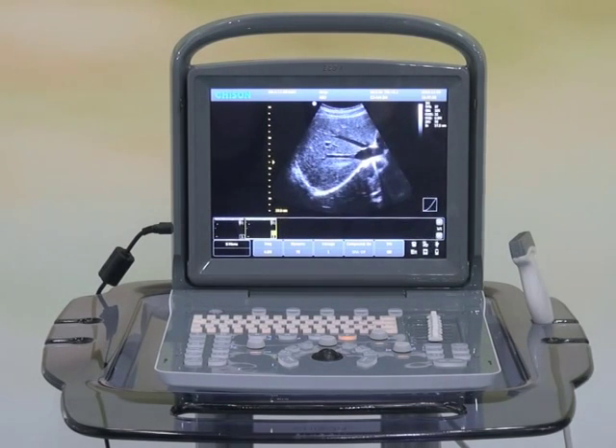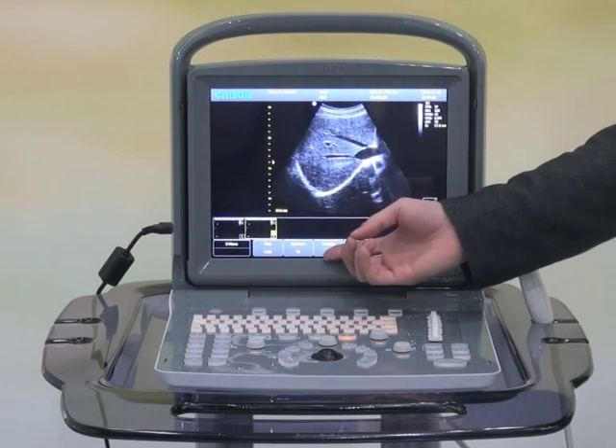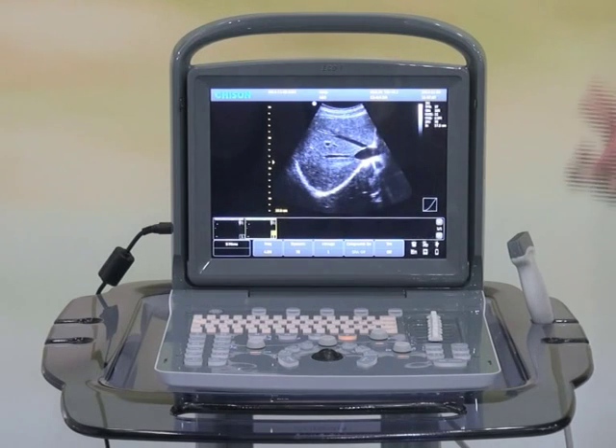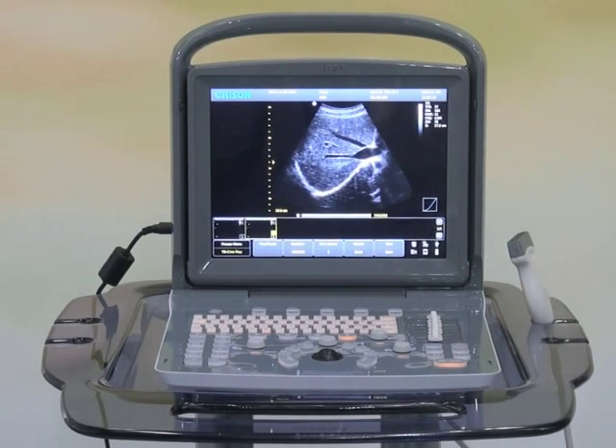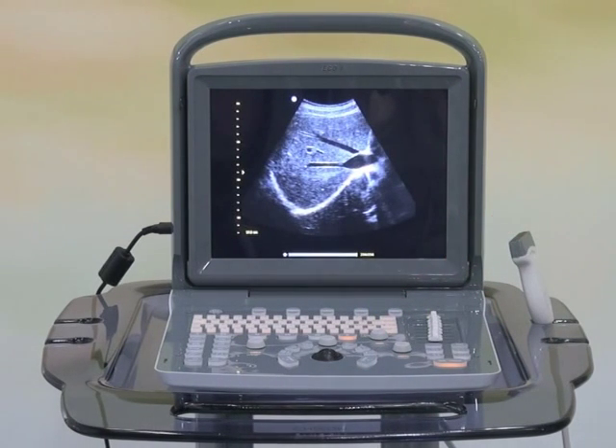Thanks to advanced technologies like THI, SRA, and iImage, the system delivers amazing images for each probe. The four-screen display mode also allows you to see more detail with less effort.